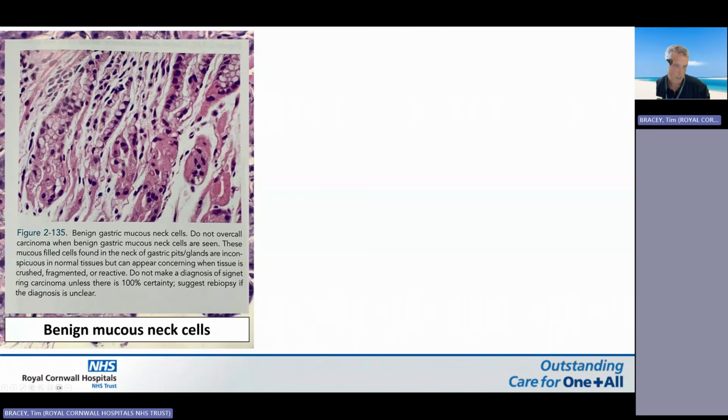But you can see that these are all in the same little band of mucosa, in the band of epithelium, and they don't lose E-cadherin, and they certainly don't infiltrate the lamina propria. They're benign and reactive phenomena.